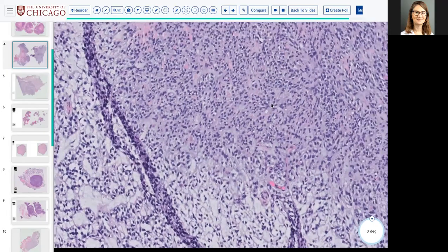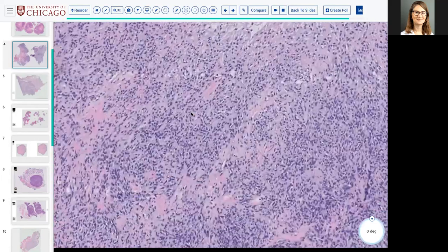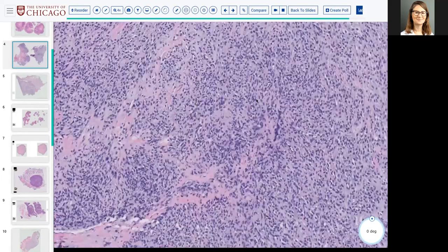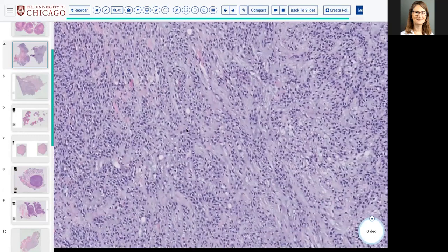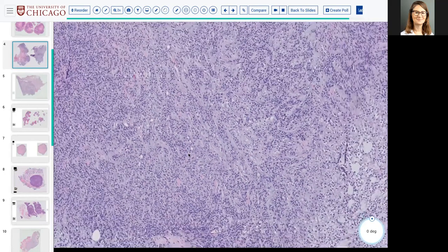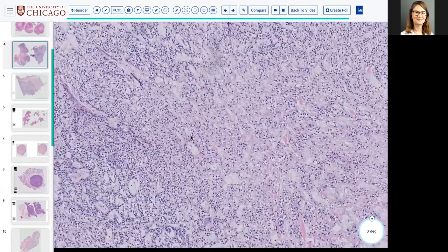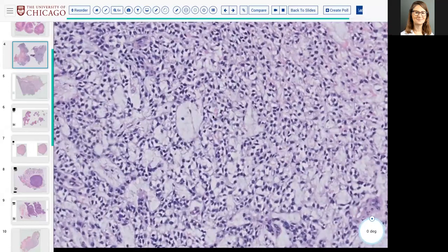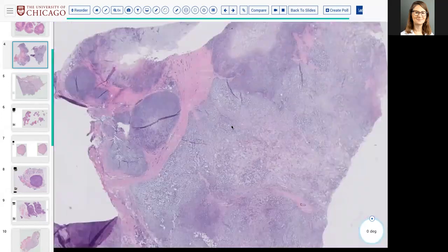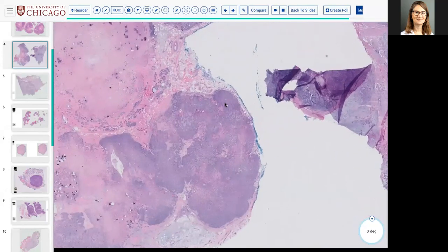I agree with you there. And as Perry was saying, for epimyoep, I don't really see punctuation by true ducts. Since epimyoep is a biphasic neoplasm, you want to have true ducts. You could throw a C-kit on here and see if any of these little lumina are surrounded by epithelial cells, which they may very well be, or they could just be pseudocystic spaces lined by myoepithelial cells that are producing this stromal, bluish connective tissue mucin. So that's thing one. That's a subtle difference that may or may not change any prognosis in this patient.